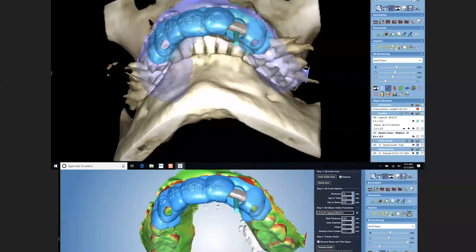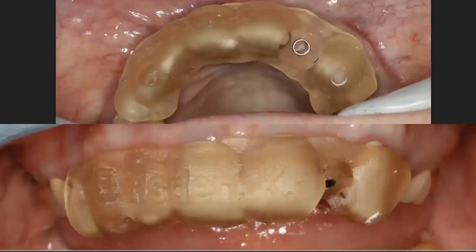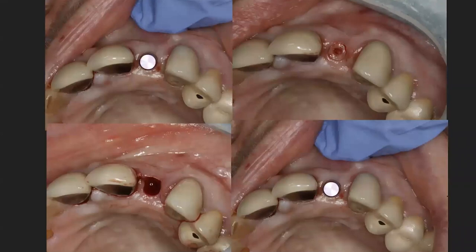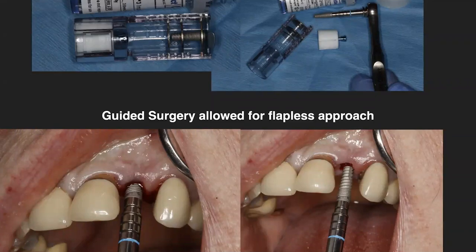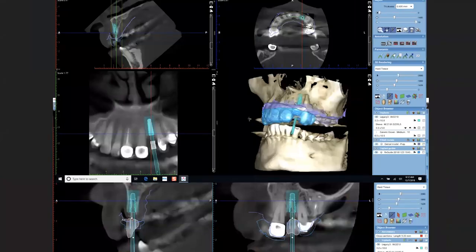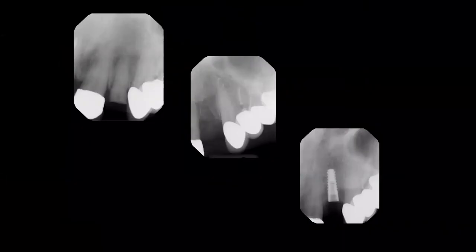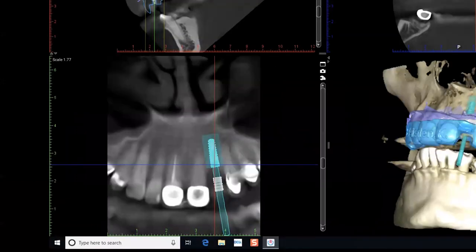Anterior cases — I love with 3D printing. This is Planmeca Romexis 3D printing software where we design our own guides to 3D print on our Sprint Ray Pro. Especially lateral incisors — there's very little to no room for error. This is what our surgical guide looks like: we do a pilot hole or fully guided. In this case it's the pilot hole and we use our tissue punch for a flapless approach, which really helps because we don't want more recession happening around adjacent crowns. This allowed a flapless approach — so key for preventing recession on number nine and so on. You have to cherry-pick your case and plan accordingly. This had good keratinized tissue, so I felt comfortable going flapless with the 3D printed guide. The post-op x-ray is exactly how we planned it.